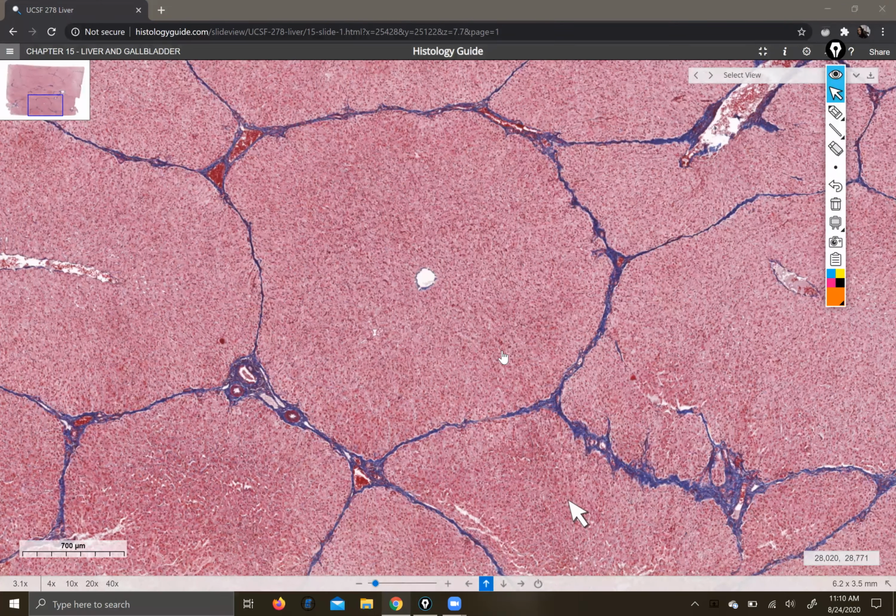Thank you. Alrighty, so you'll notice this hole in the middle. I'm gonna switch colors here because I'm thinking that you guys probably are not having an easy time seeing the orange. So this hole, that's a little bit better, is the central vein.